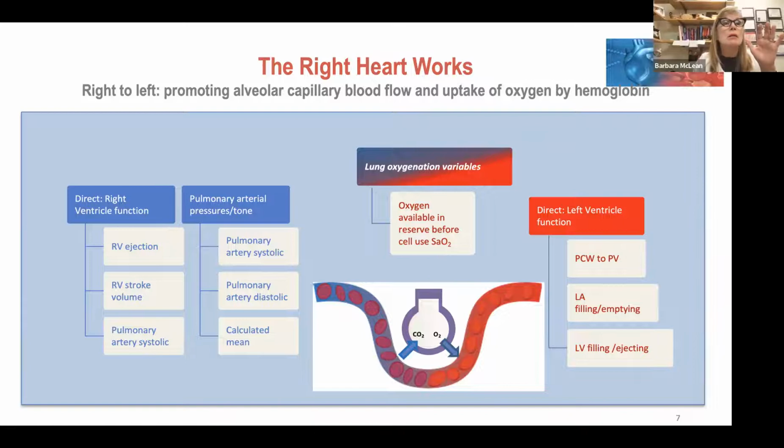Okay, CVP directly looks at right atrial pressure, which directly reflects right ventricular pressure. CVP, 2 spaces away from the right ventricle. It's in the central vein or it's in the right atria, then it's only 1 space removed from the right ventricle. Wedge pressure, left ventricle, left atria, pulmonary veins, pulmonary venules, and the pressure here measured in the pulmonary capillary, 5 spaces removed.